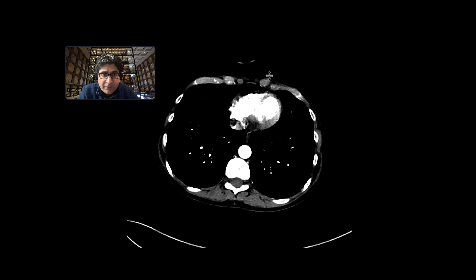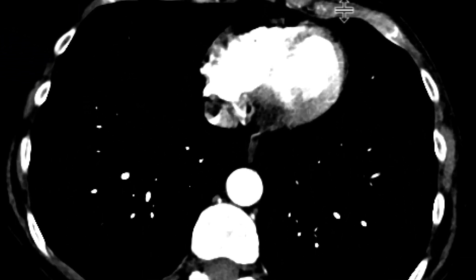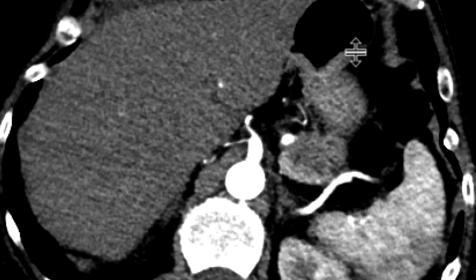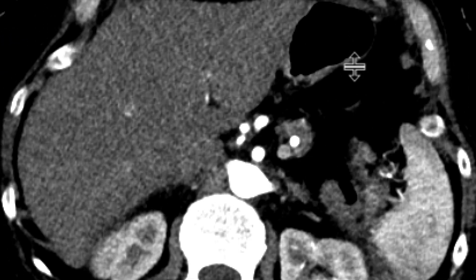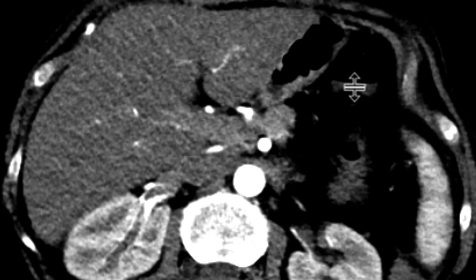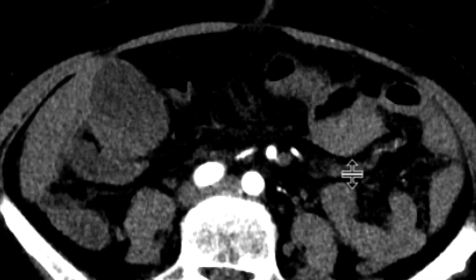This is a patient with a known carcinoid tumor, and we were asked to evaluate it with CTA imaging. We'll show you the CTA imaging of this patient done in the arterial phase.